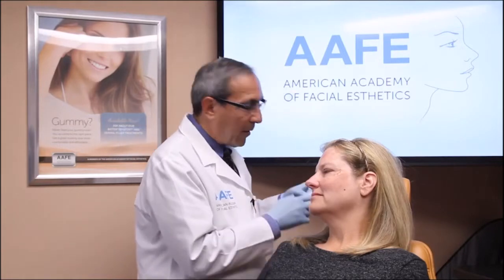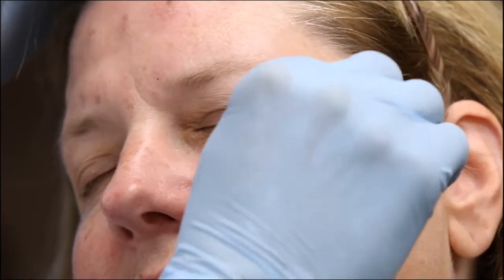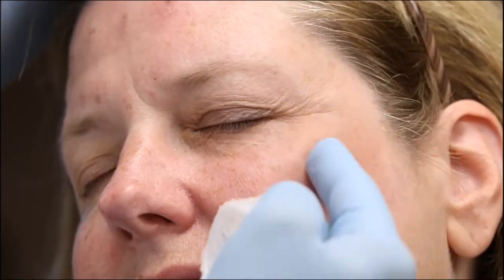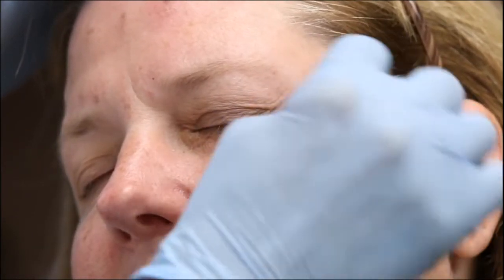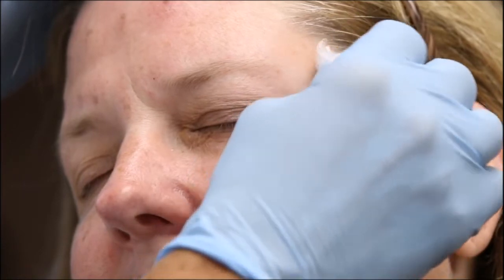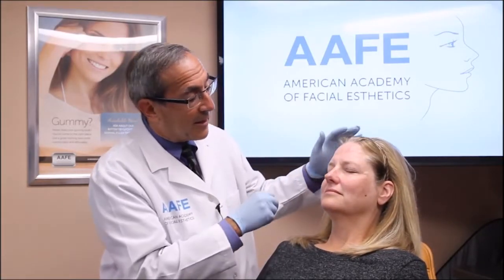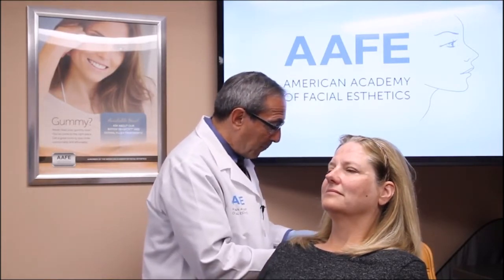The delivery doesn't take very long, and this will take about 2 to 10 days to kick in. I want to make sure we're pushing this in the right direction. There's no bleeding or bruising visible right now. In this area there is a lot of venous complex, so it's easy to get a bruise, but usually you'll see it right away — and I don't see anything on her, so we're not anticipating much.